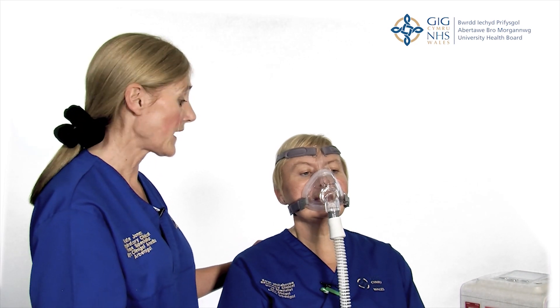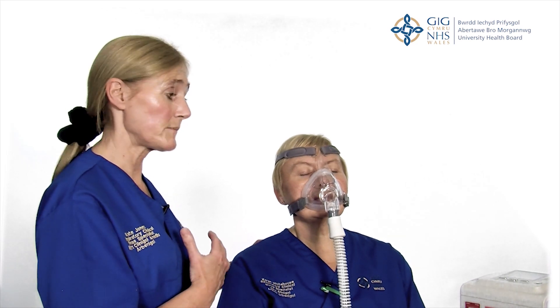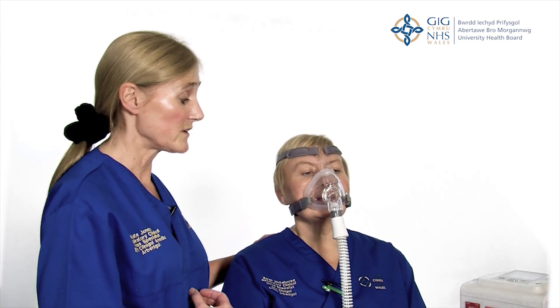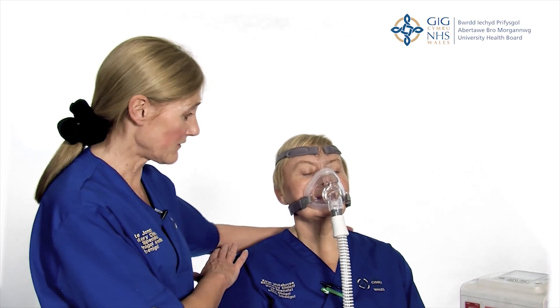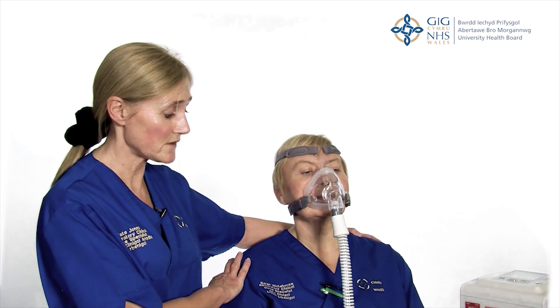It's very important that you reassure patients at all times and explain to them that all this machine is doing is giving them a bigger breath and the best thing they can do is to relax and allow themselves to experience the bigger breath. We tell them it can't do them any harm and it's just going to help them get rid of the carbon dioxide which is building up in their system and making them unwell. As you can see Karen is nicely relaxed, her shoulders are down and there's good chest expansion.